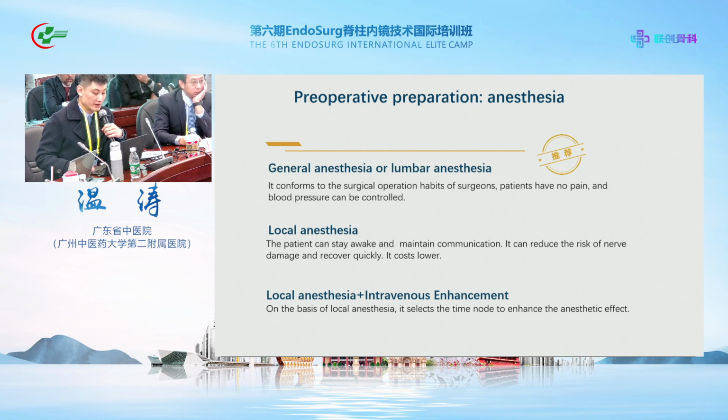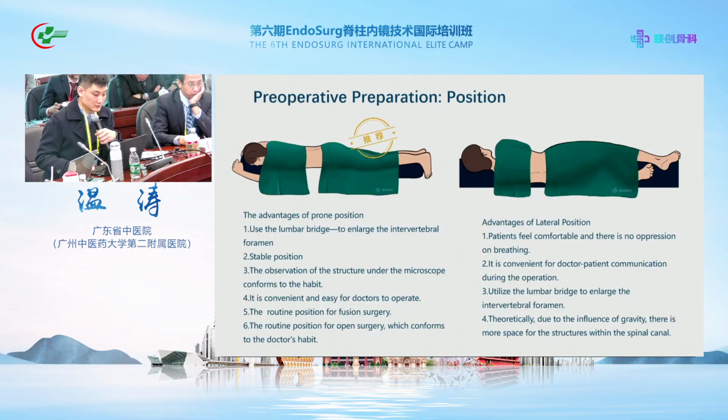And for the position, we recommend the prone position because most surgeons are familiar with this position, like in traditional open surgery. And this position is very stable, and it is convenient and easier for the doctor to operate.